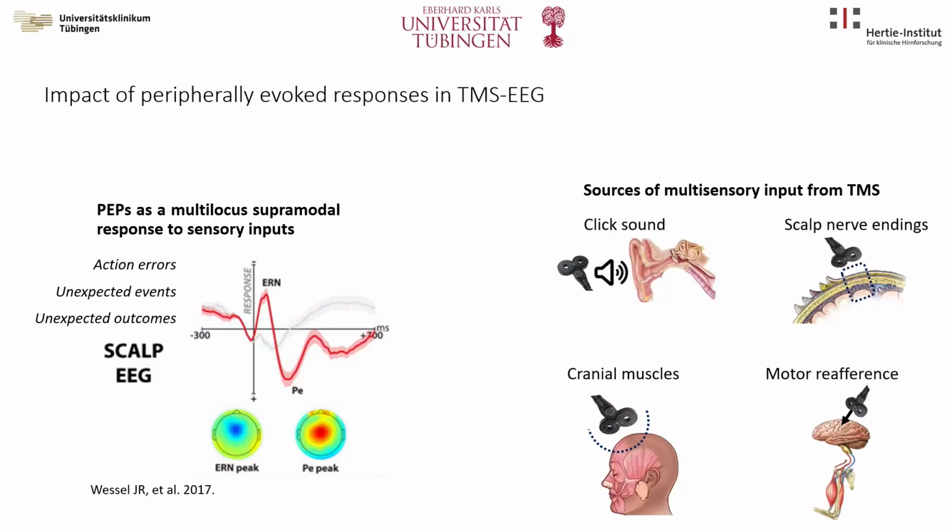So, what is the consequence of this? The consequence is that, well, if I then use TMS-EEG to, for instance, probe the cortical modulation to a substance that I'm experimenting, or, for instance, a disease, see if the TMS-EEG responses in a clinical sample are different from a healthy one, well, what you're seeing then, is it the modulation of this direct focal stimulation of the cortex, or is it just the modulation of this event-related potential?